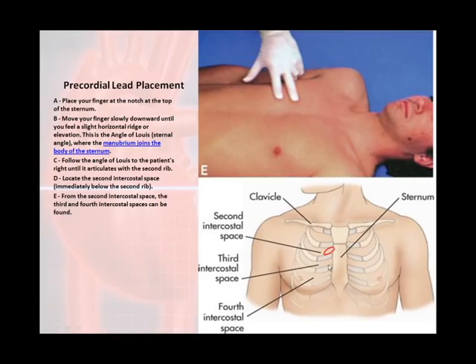So here's my second intercostal space, there's my third intercostal space. Here is my fourth intercostal space. This is the spot that I'm actually looking for right here.